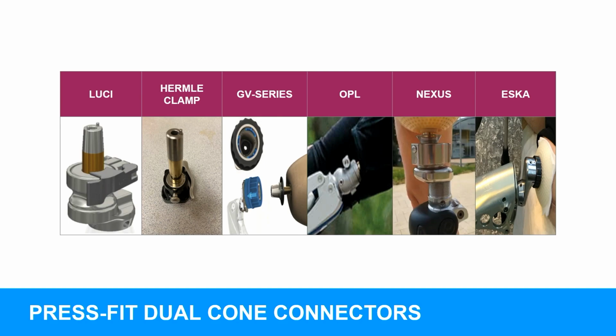This is going to be the difficult part for most prosthetists, and I think I need to develop like an OI calendar and every year send one out to you guys and say, here are the connectors, here's the IFUs, here is the torque settings. So emergently, if somebody walks into your office, you'll know exactly how to tighten these and take care of these patients, if you're willing.